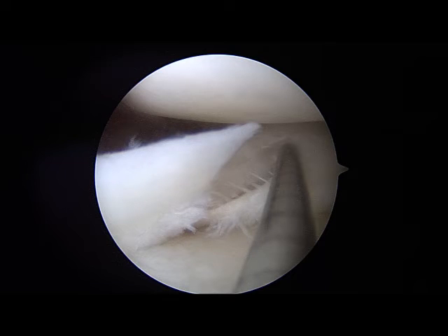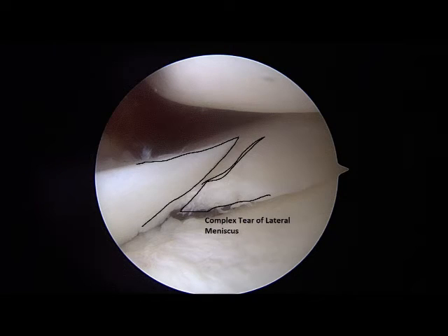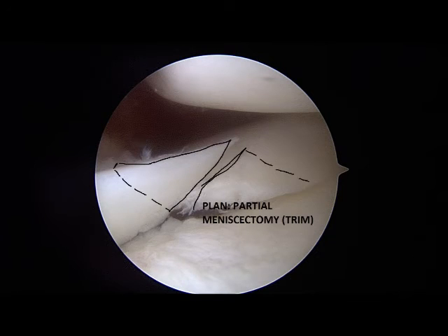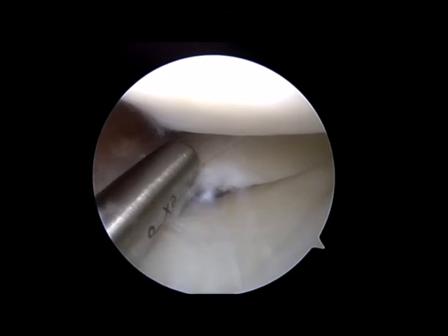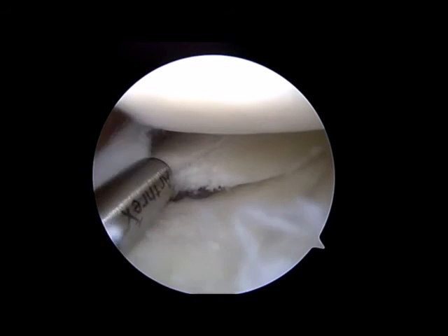My surgical probe is brought in. I inspect the tear. The various planes are identified. It's determined that it is a complex tear within an avascular zone. Therefore, I make plans to trim the main fragments. A shaver is brought in. The shaver is an instrument that is used to trim loose cartilage and meniscus fragments. The main fragments are trimmed back.